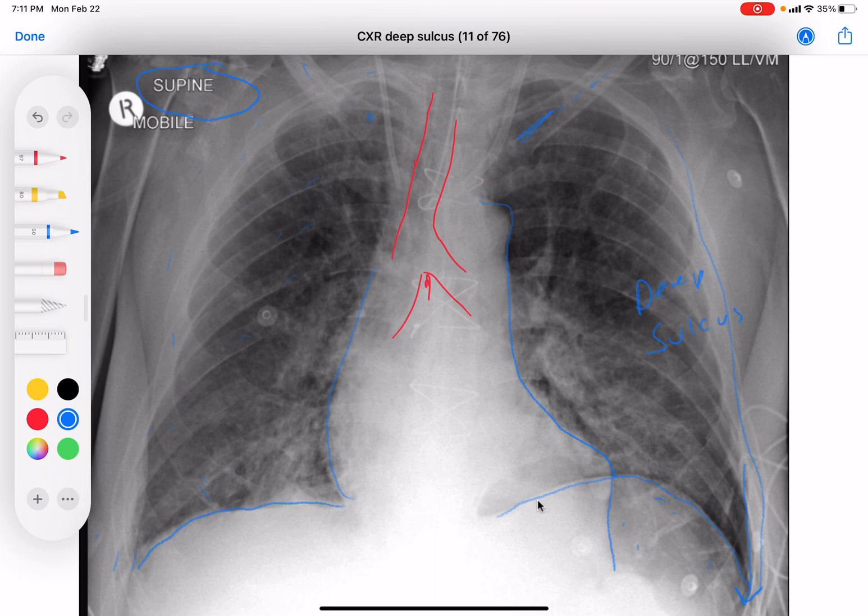The deep sulcus sign happens on a supine chest x-ray and it's indicative of a pneumothorax. This patient has a pneumothorax, and most assuredly will need a chest tube because it looks like a pretty good-sized one. A CT would definitively show how big it is.